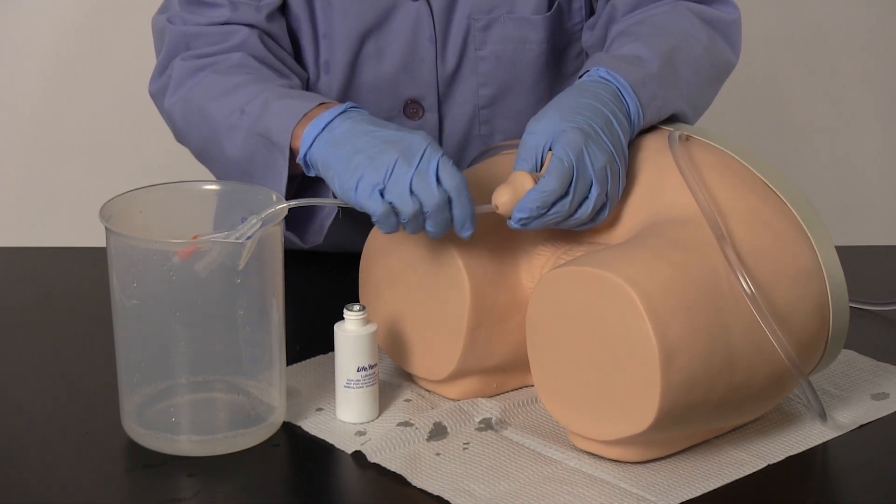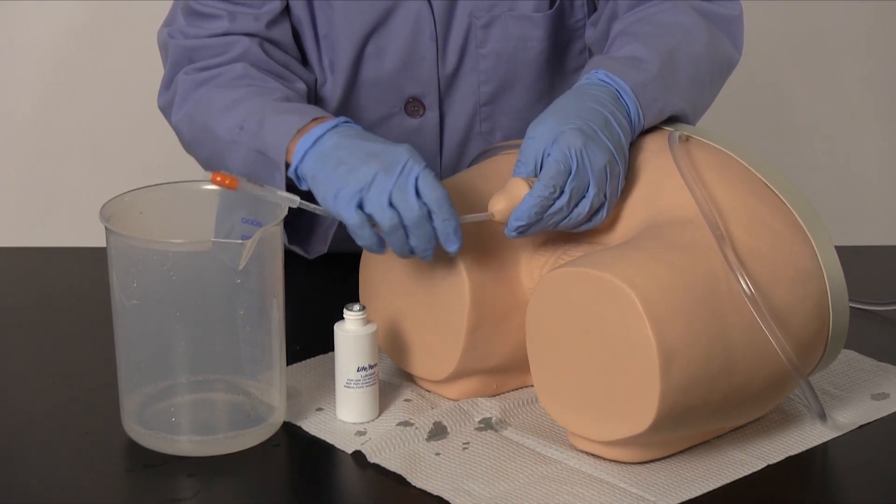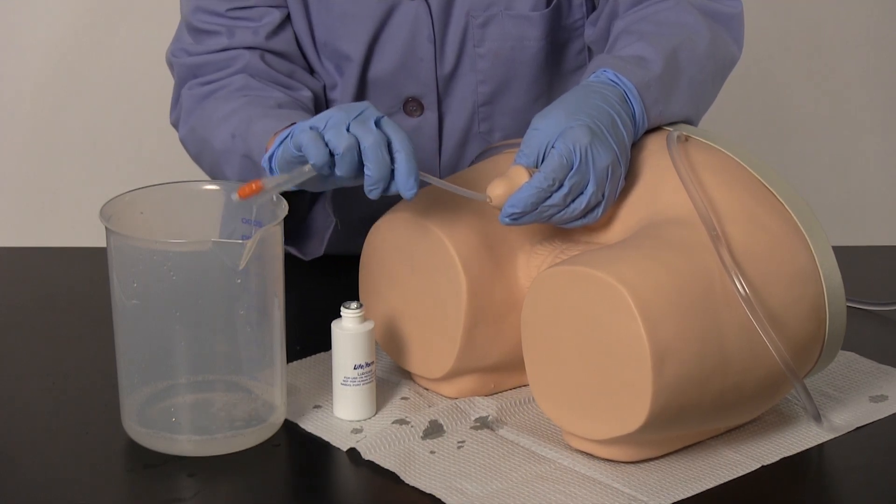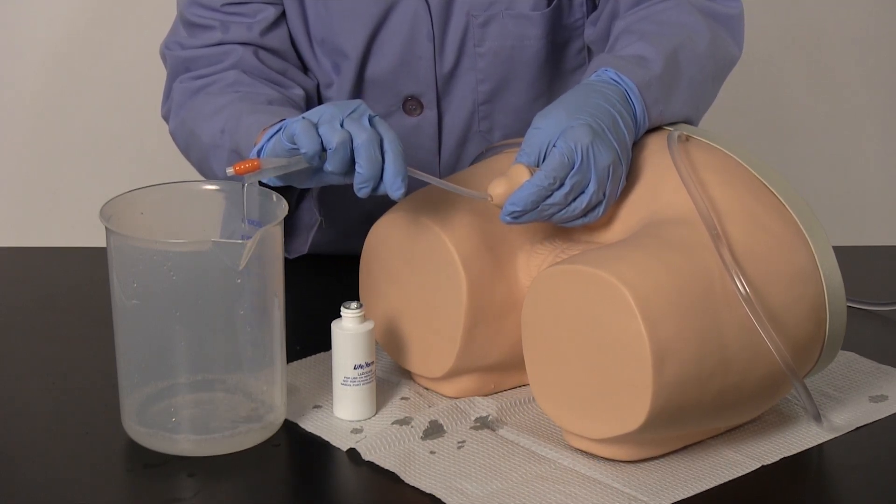Gently elevate the penis 60 degrees to straighten the urethra and proceed with insertion. The final restriction is the simulated sphincter when entering the bladder. Lower the penis and continue inserting. You will feel a slight pop as the catheter enters the bladder. Continue inserting until water flows from the catheter.